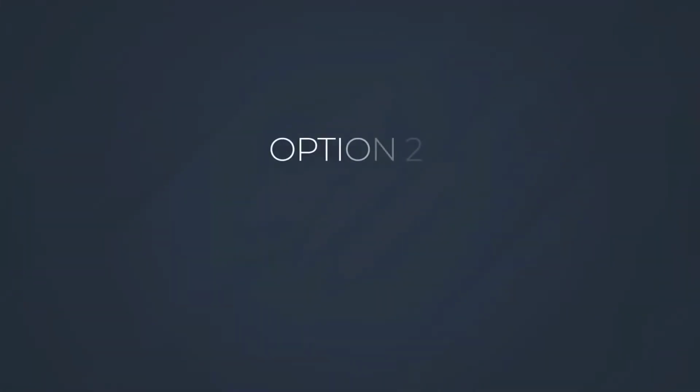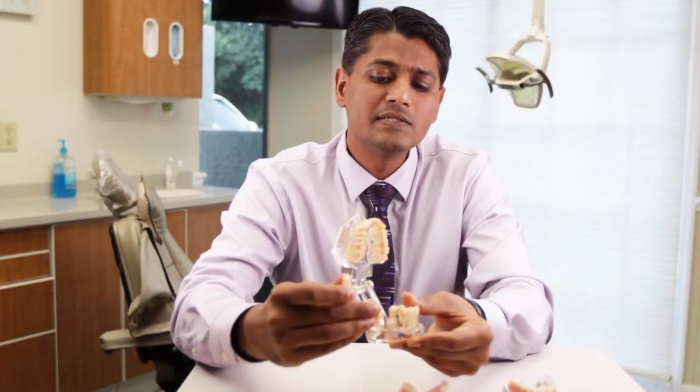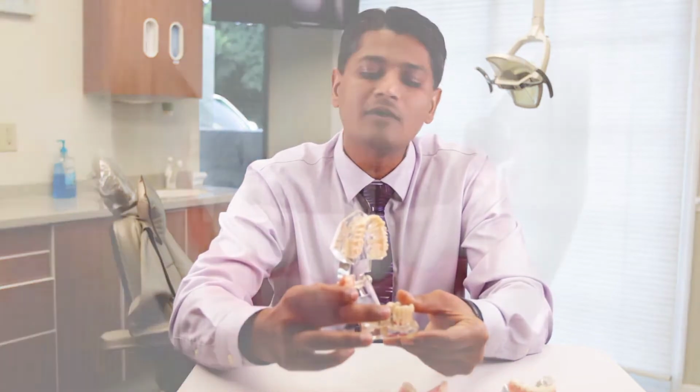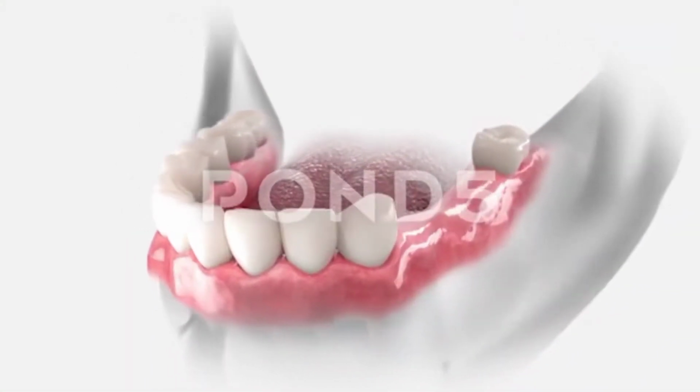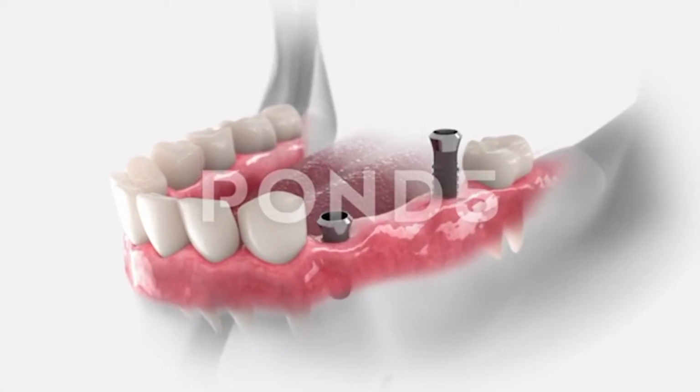Now patients ask me what happens if they are missing more than one tooth. Very simple: depending on how many teeth they are missing in the arch, which is one section of the entire area of their jaw, we could plant numerous implants. In this situation, a person is missing 3 to 4 teeth on one side, so we are able to plant one implant in the front and one implant in the back, similar to the single implant.